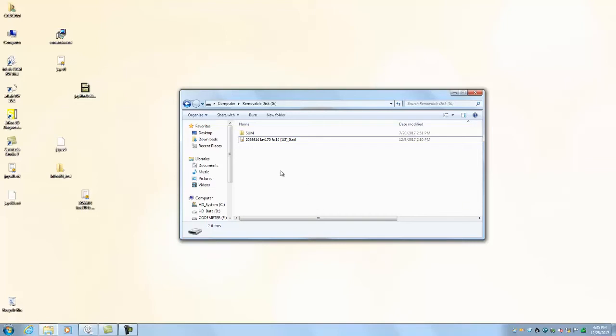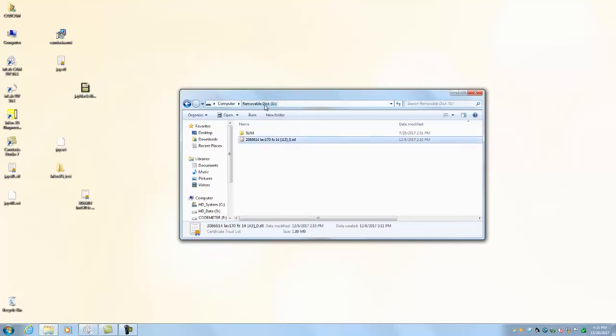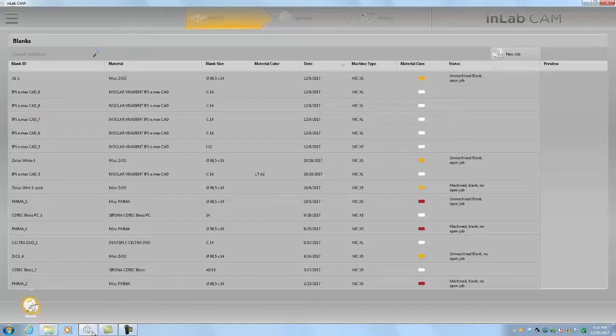You can see I have a removable flash drive that's mapped to my computer's G drive and it has an STL file that came from 3-shape. I believe it's a single crown. I'll show you the process for getting this imported into the in-lab software.